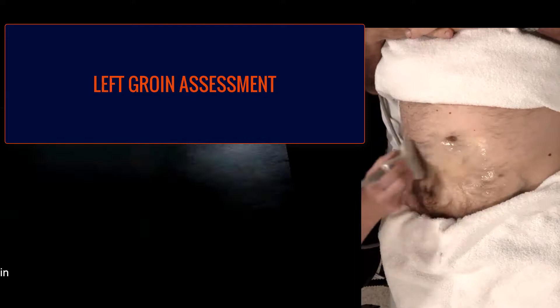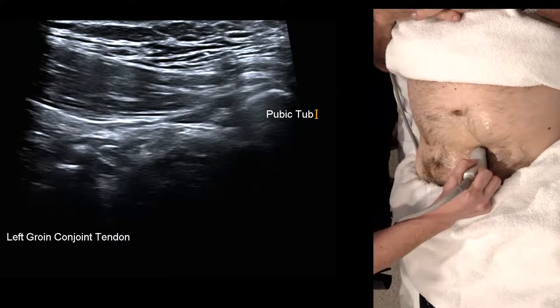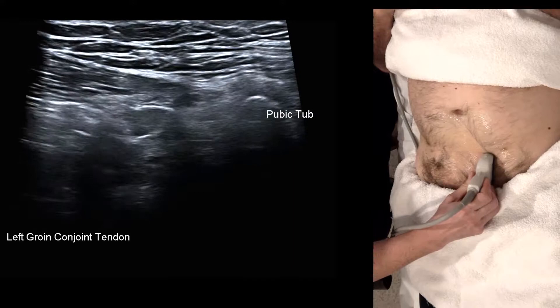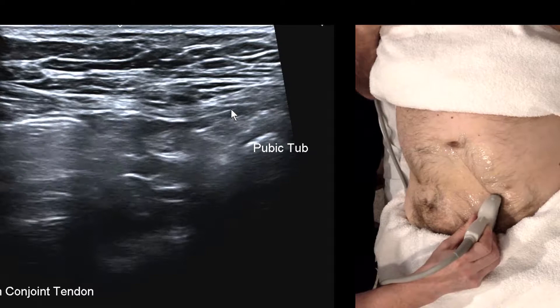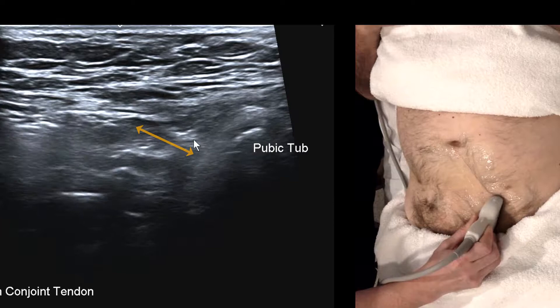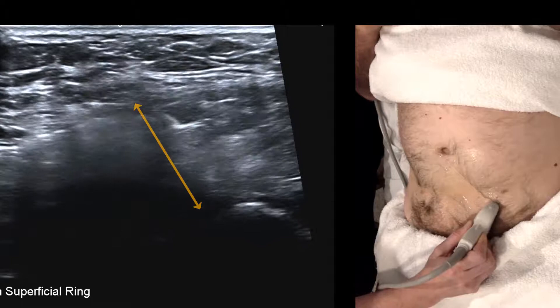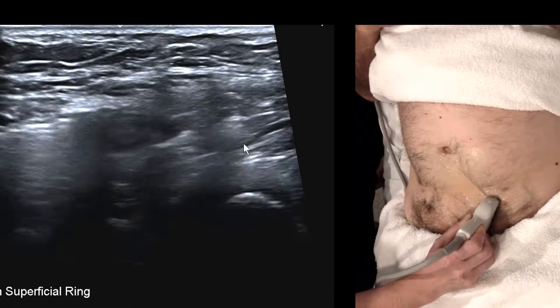Moving on to the left side - looking at the superficial ring first. Find the rectus abdominis with the pubic tubercle inferiorly, then move a little bit laterally and we can see nothing but a white line - this is the conjoint tendon. Immediately lateral to that, take the pressure off and start looking for veins coming from deep to superficial. The roof of the inguinal canal has a gap from the pubic tubercle onwards - that's how we know we've arrived at the superficial ring. On strain, something is clearly moving in front of the pubic tubercle - there's definitely a hernia.